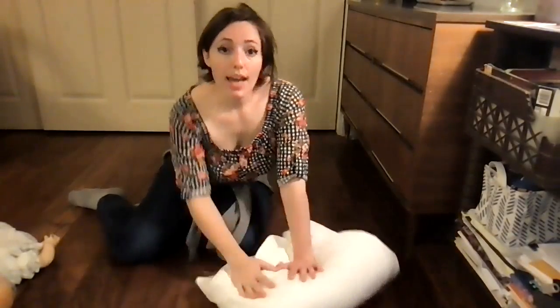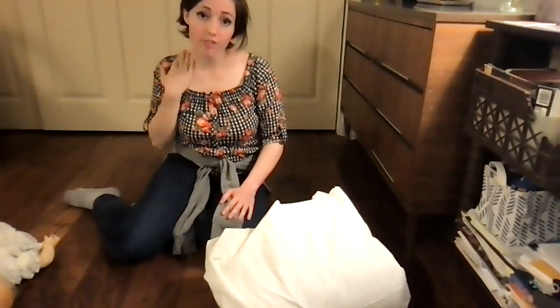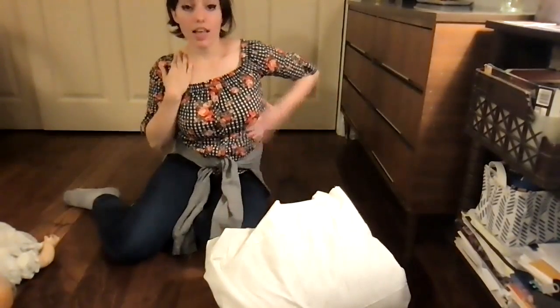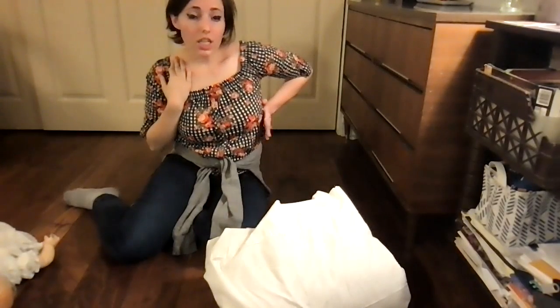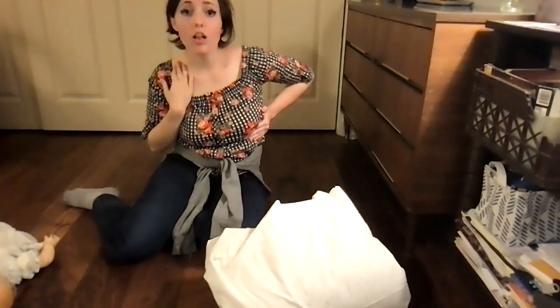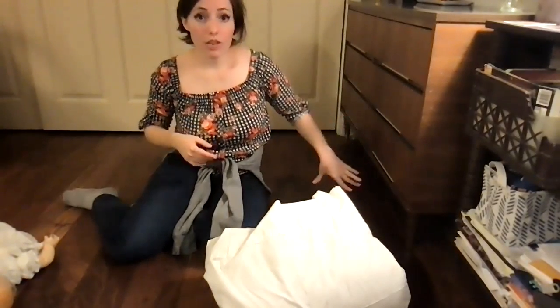Attach an AED when you get it. You're gonna put one pad over the right upper chest, kind of right clavicle, and the other on the left underneath their pec, kind of a little lateral. And then you're going to hook it into the AED, turn the AED on, and follow the instructions.